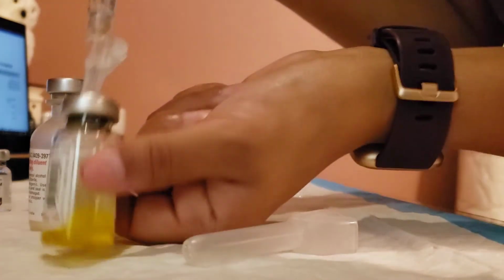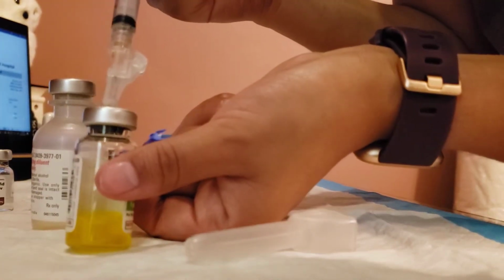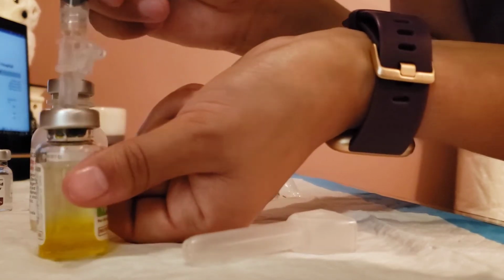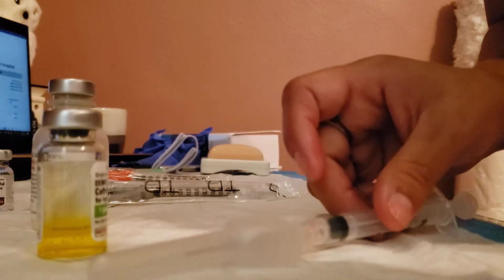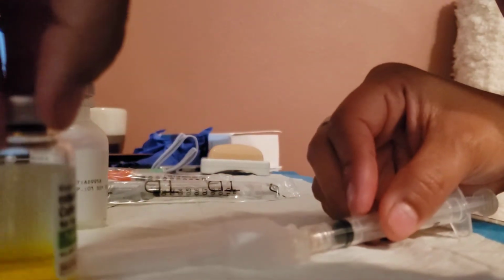While I'm doing this, if it was powder, I would swirl it around and make sure that I'm getting water on the walls just to get everything off. I'm going to go ahead and pull that out and recap my needle here. And I'm going to also move my camera so that you can see better.